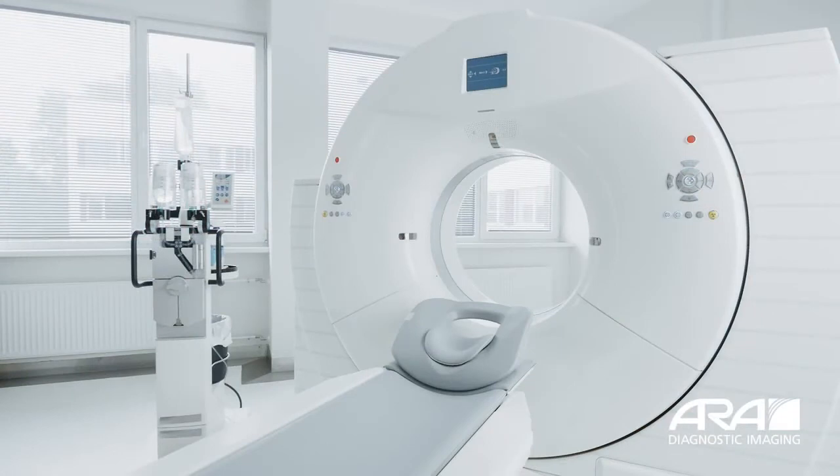Yeah, sure. Most people outside of medicine will still call them CAT scans. It's just part of the old acronym. But basically what that's doing is compiling a bunch of x-rays. Almost everyone knows what it's like to have an x-ray done, and in reality, most people have probably had a CT as well. What it's actually doing is taking lots of x-rays, and then a supercomputer puts those together. By adding them in from different angles around the circle, you can end up doing all kinds of very, very cool things with it. Amazing. And you end up with this incredibly detailed image, which we're going to see here in a minute.